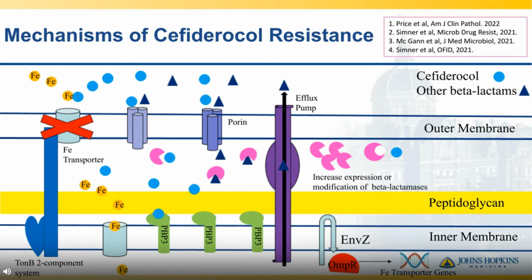So this case is an example of increasing the expression of that beta-lactamase to then provide resistance or elevated MICs to cefiderocol.